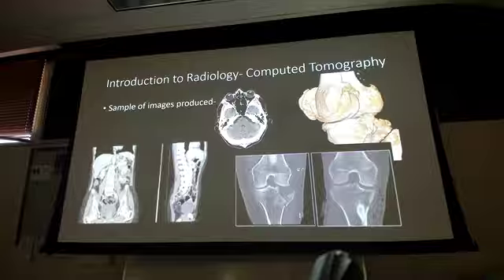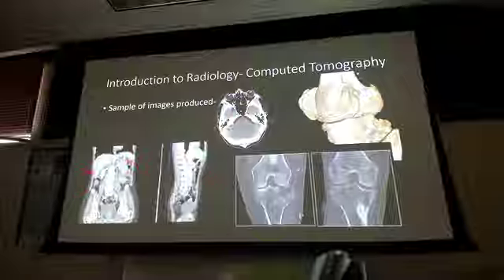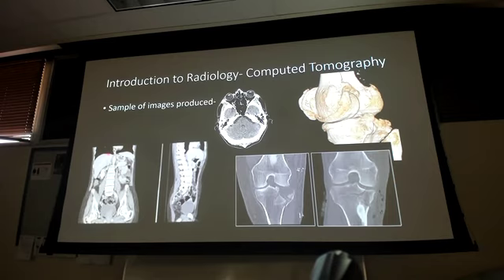This here is an abdominal CT, okay? This is with contrast, look at how nice the liver stands out, spleen, right? Liver and spleen. Can't really see the kidneys that well here yet. I got some bladder down here, and we'll see some better organs and better pictures of that, so you can see how much more detailed that is. So you can imagine if I had a knife going into the torso there, I can actually take a look and see, did that miss the liver, did it hit the liver, then what are we dealing with here?